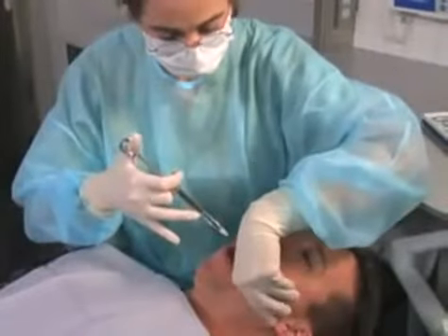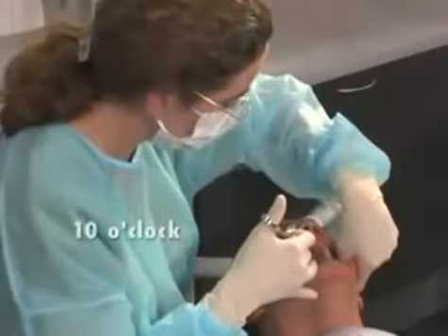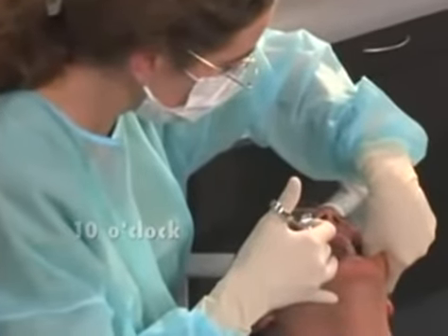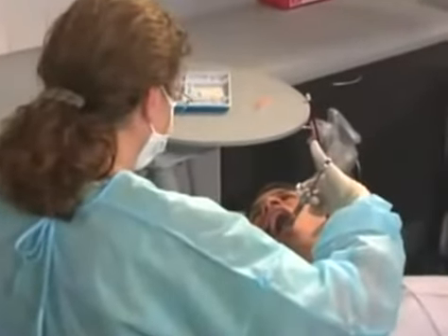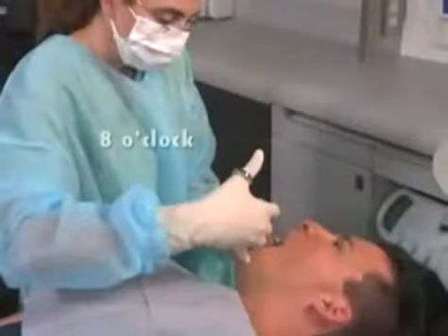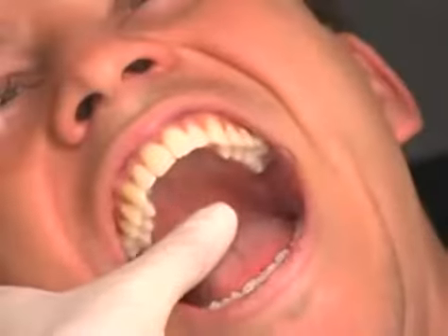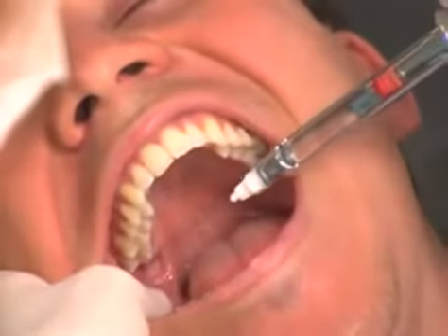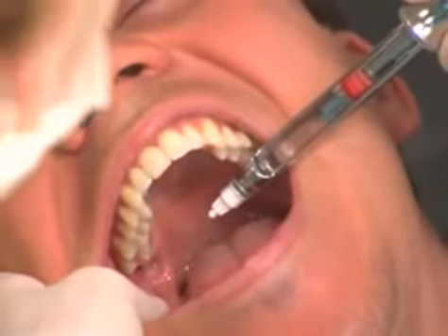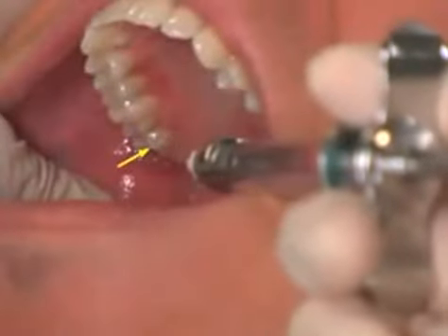For the left Gow-Gates mandibular nerve block, the right-handed operator should sit in a 10 o'clock position, facing in the same direction as the patient. For a right Gow-Gates mandibular nerve block, the right-handed operator should sit in the 8 o'clock position, facing the patient. The coronoid notch is palpated. The barrel of the syringe is placed in the corner of the mouth on the opposite side, and the needle tip is placed just below the mesiolingual cusp of the maxillary second molar.